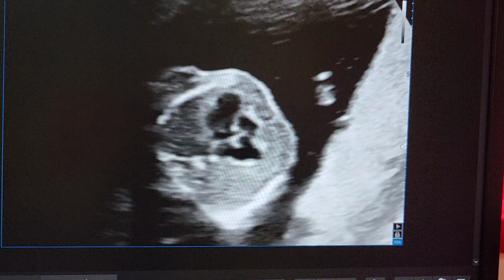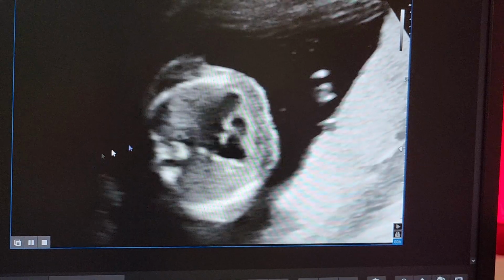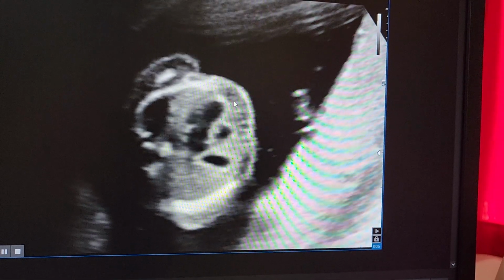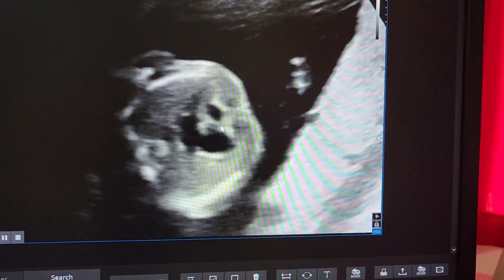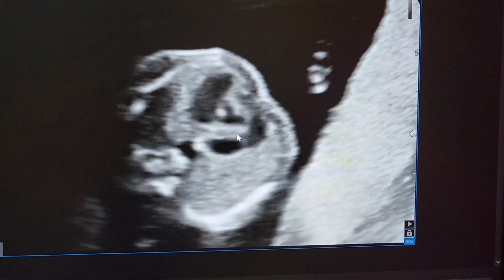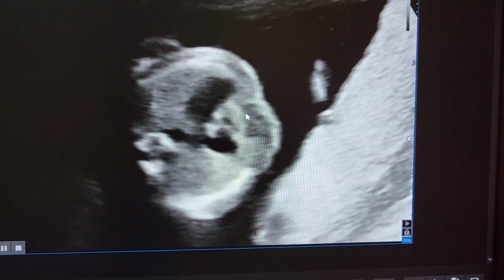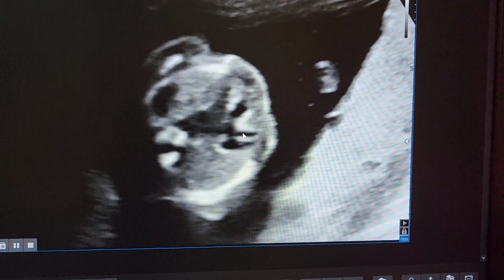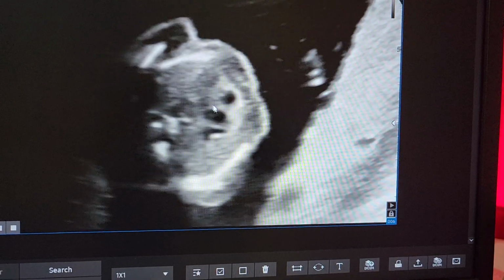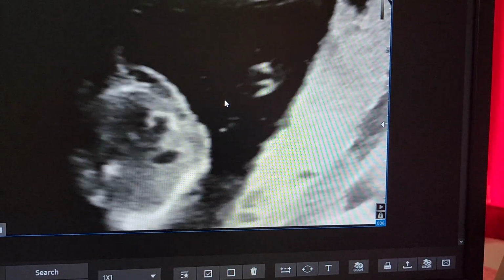Now we try to proceed and look at what the anomaly is. We try to get the apex of the heart anteriorly and we are looking at a cine and we realize that not only the interventricular septum, but also the free wall of the right ventricle, the tricuspid valve and a little bit of the crux is all echogenic, and there are echogenic intracardiac foci in the right ventricle. So that is the observation in terms of echogenicity changes. Also you can see that the left ventricle size is normal whereas the right ventricle size is small.